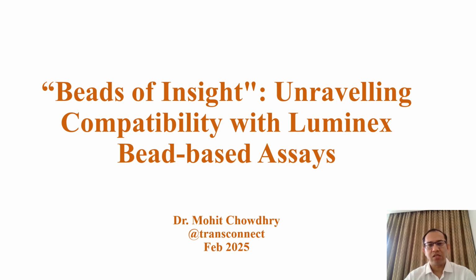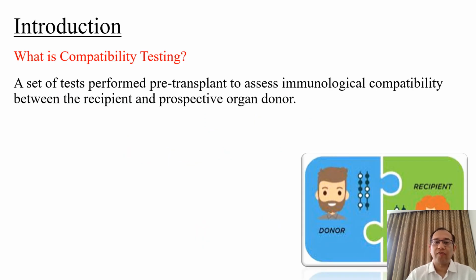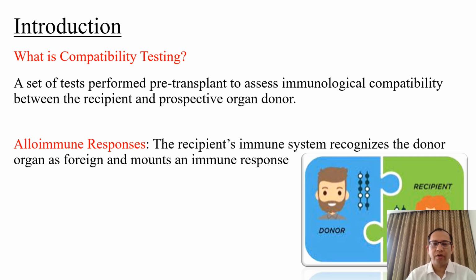The topic for today is Beads of Insight: Unraveling the Compatibility with Luminex based bead assays. So what is compatibility testing? It is basically a set of tests performed pre-transplant to assess the compatibility between the recipient and the prospective organ donor. And what is an alloimmune response? It is when the recipient's immune system recognizes the donor organ as foreign and mounts an immune response. That is the alloimmune response.